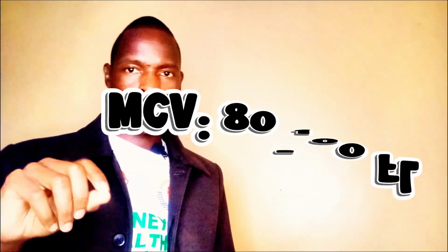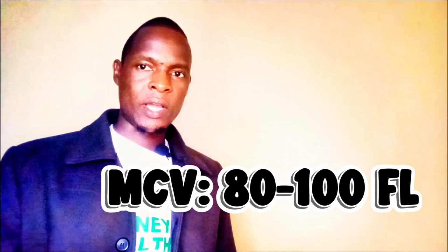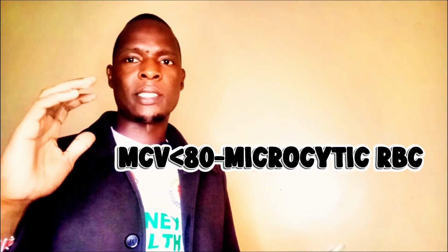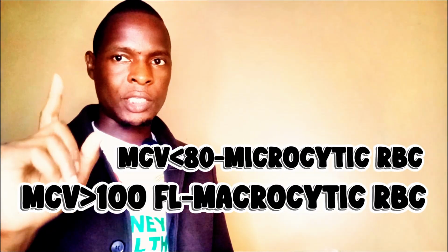So the mean corpuscular volume in your report will indicate whether your red blood cells are of the right size, whether they are too small or too big to perform their function, or they are perfect in their size in order to perform their function. And the size averagely is normally around 80 to 100 femtoliter. A value of red blood cells that is lower than 80 is considered microcytic, and that is abnormal. And a value that is greater than 100 is considered macrocytic, and that also is abnormal.